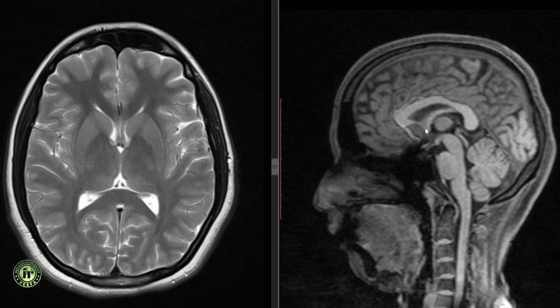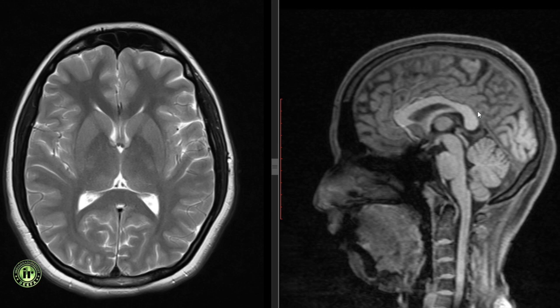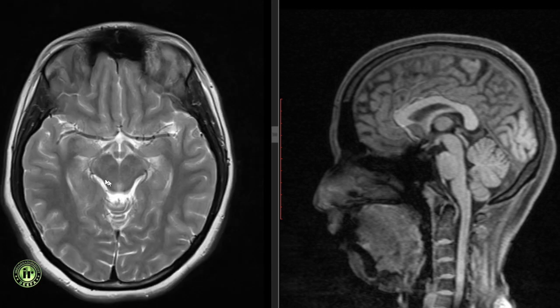Superior to the suprasellar cistern is the cistern of the lamina terminalis containing the anterior communicating artery, and superiorly is the callosal cistern containing the pericallosal artery. The cistern of velum interpositum is limited anteriorly by the interventricular foramen of Monro; it communicates posteriorly with the quadrigeminal plate cistern and contains the internal cerebral vein. The quadrigeminal plate cistern lies along the superior surface of the cerebellum and is the location of the venous confluence of the vein of Galen with the inferior sagittal and straight sinuses. It contains the posterior cerebral, posterior choroidal and superior cerebellar arteries. The ambient cistern surrounds the midbrain and contains the posterior cerebral and superior cerebellar arteries, the basal veins of Rosenthal and the trochlear nerves.